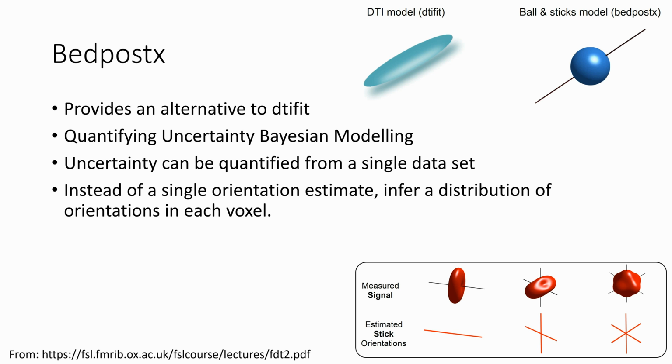So the bedpost method is also called the ball and stick model. The difference from the general diffusion model, where you just have a general sense of how skewed a voxel is and the direction of skew, is that you build up a vector, and it can have multiple vectors through. These optional vectors have an uncertainty to them. There's a number of different fits that could work, and by lining these all up together with the uncertainty of where they might be going, their probable direction, you can start pathing down all different probable tracks until you have a setup of roads that make sense.